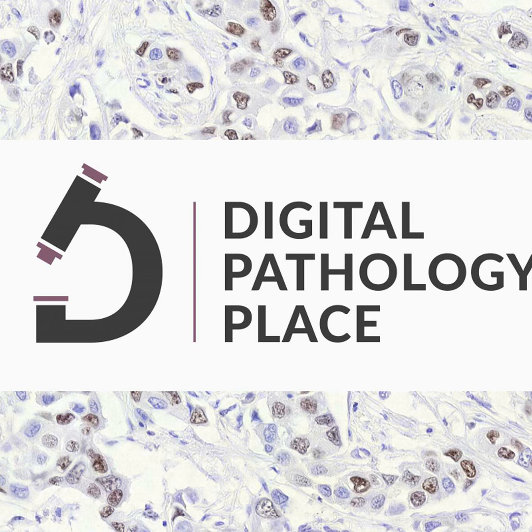It is important to clarify that the focus of this technology is not the creation of 3D or dynamic zoom images, but rather flat two-dimensional images. B. The role of WSI in generating pathology reports. These images are critical for routine assessments as they contain the information necessary for the pathologist to generate pathology reports, which are key data components in non-clinical, preclinical toxicologic pathology adhering to GLP regulations.